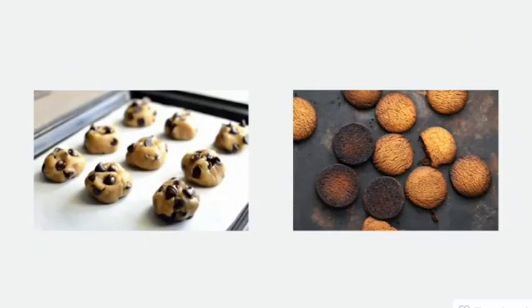It's kind of like baking cookies. The cooking time and cooking temperature doesn't have to be exactly right, but it does have to be close. Baking the cookies too cool or taking them out too soon results in doughy cookies that nobody wants to eat. The cookies never got enough heat to cook correctly. That's kind of like quantum mottle. Baking cookies too hot or too long results in burnt cookies, and that's kind of like saturation.